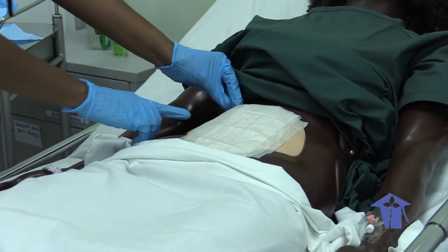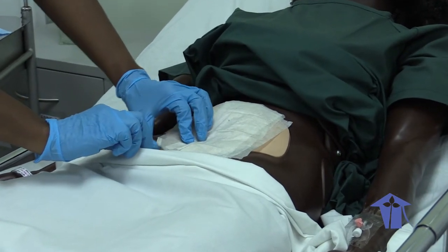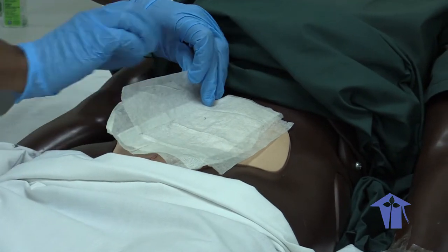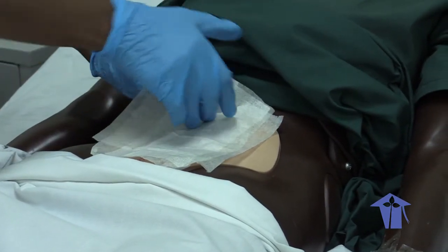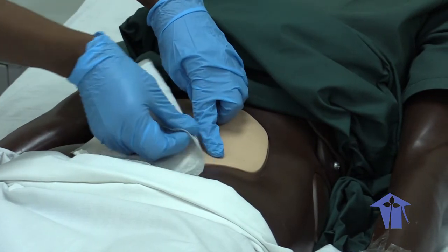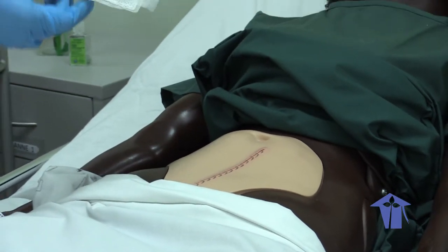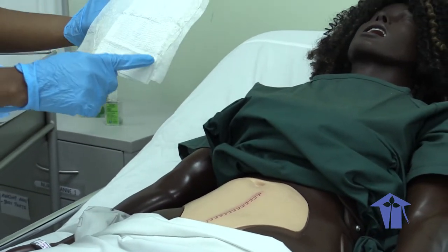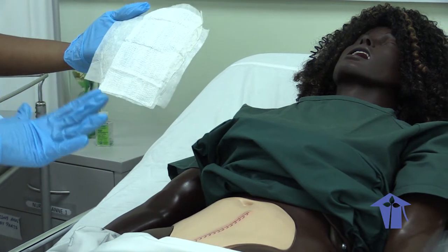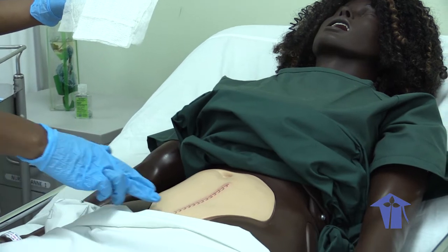And remove the wound dressing without causing pain to the patient. Once you have removed the dressing, observe the area for any soiled presentation. Also, observe the patient's wound for documentation.